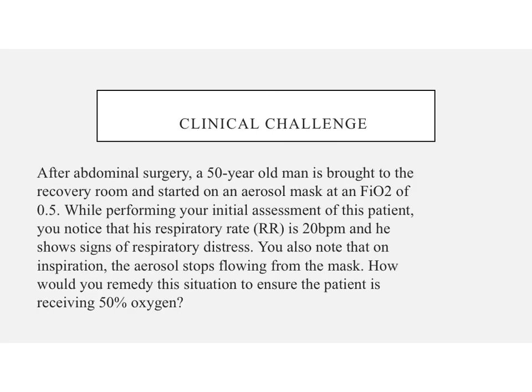So our last slide in this lecture is a clinical challenge. After abdominal surgery, a 50-year-old man is brought to the recovery room and started on an aerosol mask at an FiO2 of 50%. While performing your initial assessment of this patient, you notice that his respiratory rate is 20 breaths per minute and he shows signs of respiratory distress. You also note that on inspiration, the aerosol stops flowing from the mask. How would you remedy this situation to ensure the patient is receiving 50% oxygen?